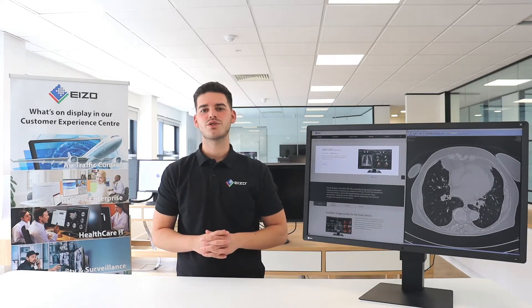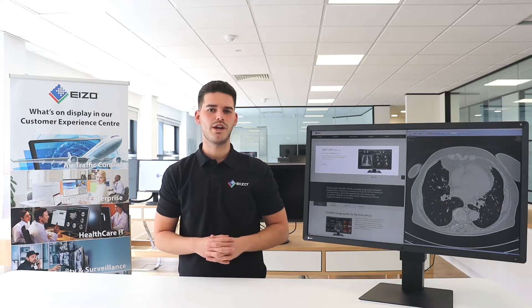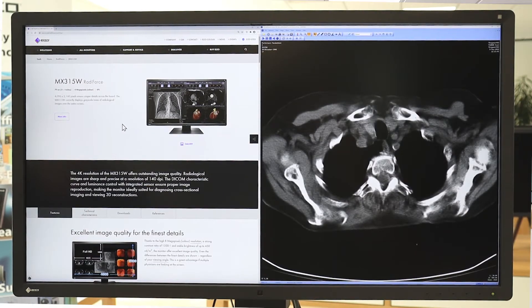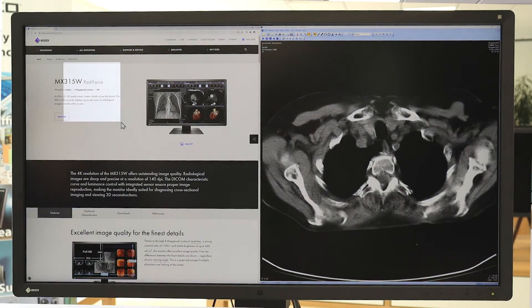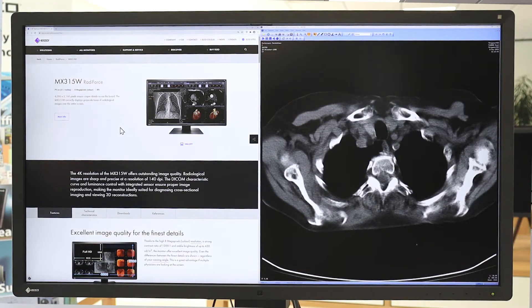Our point and focus function allows you to quickly select and focus on relevant image areas using your mouse or keyboard. By adjusting the brightness and grayscale, you can highlight parts of an image by dimming the surrounding areas — useful when viewing images with a lot of bright areas. The point and focus feature makes it easier to focus on areas of concern and is also helpful in a teaching environment or when seeking assistance from colleagues.